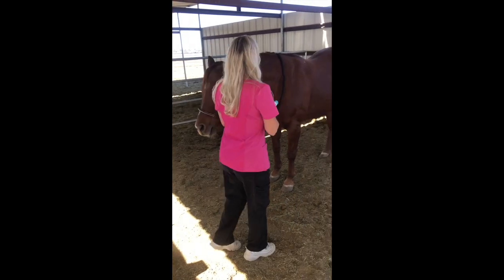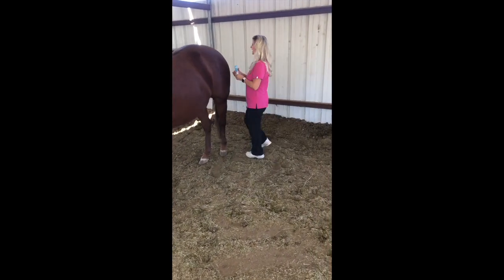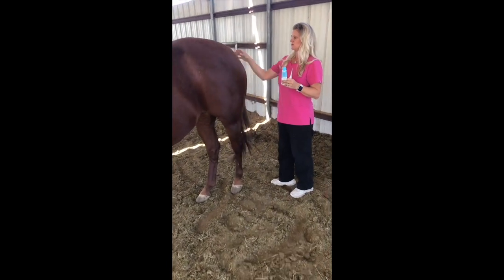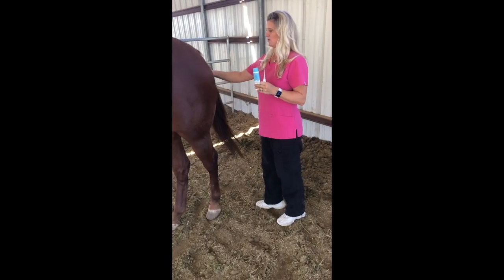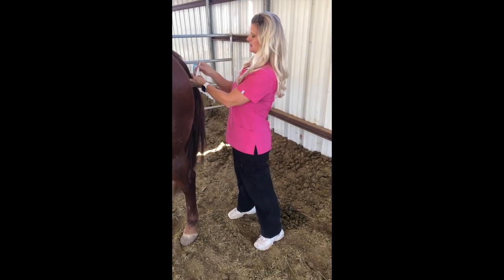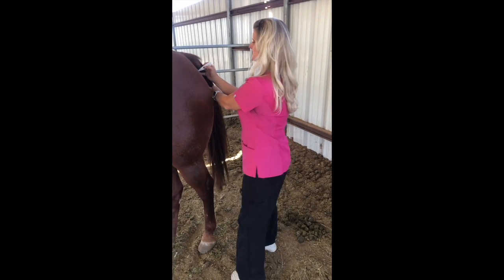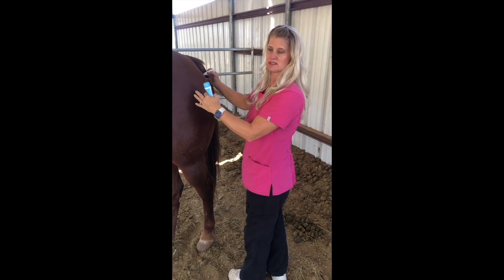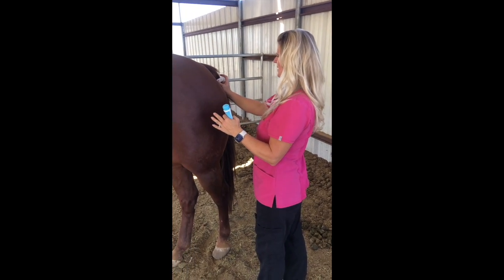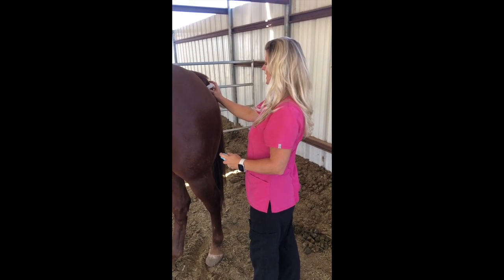And then you're going to safely walk around your horse. And if you prefer, you can use vet wrap to wrap the tail if you don't want to have the hair in the way. Or you can just simply use the tail just the way that it is. Okay, and then you just insert. Now you want to stand over to the side because if your horse is not used to this, they could kick. Okay, but you just insert the digital thermometer and push the button. You can hear the beep. And then you just wait.